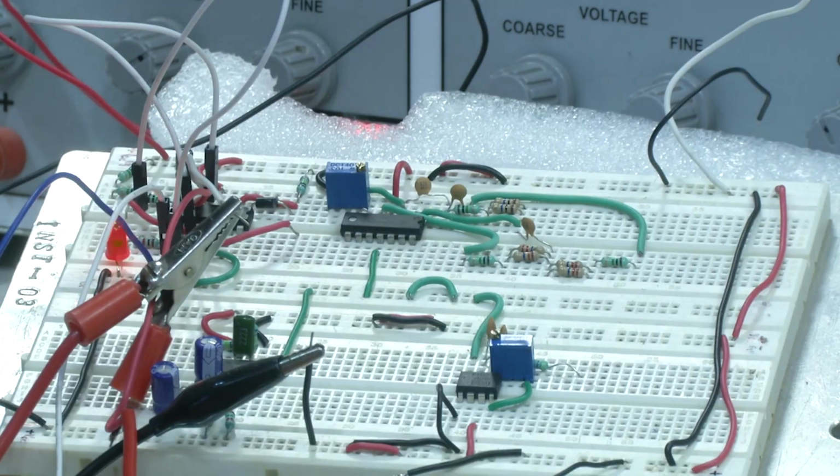Now, if we connect the output of this to a digital counter, we can easily count how many pulses we are getting. And if we create some clock cycle for a particular time period, how many pulses we are getting gives us the BPM, beats per minute. So, we have seen from the individual subsystem point of view whether it is working as per our requirement or not.